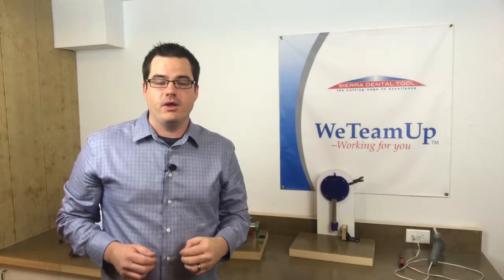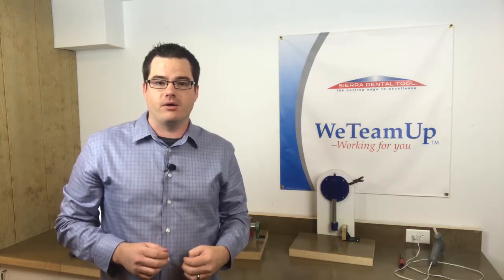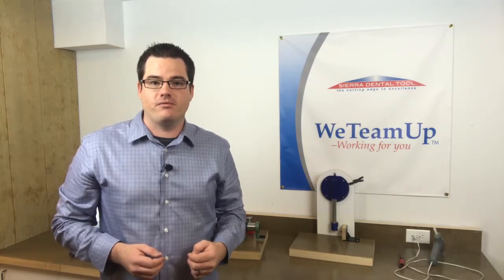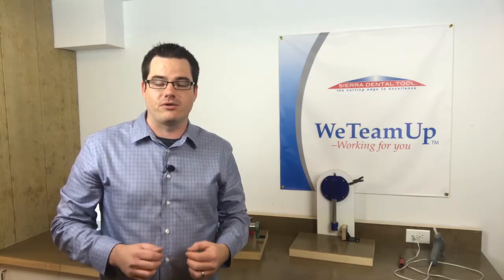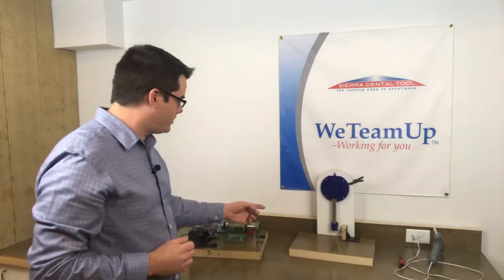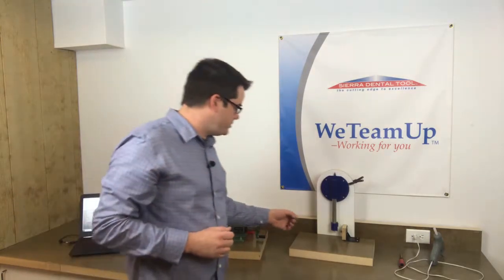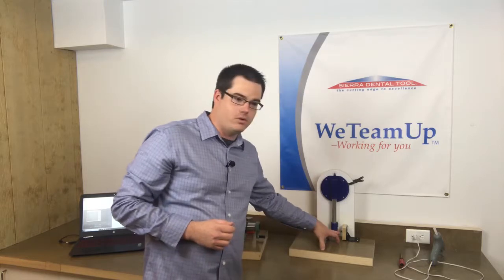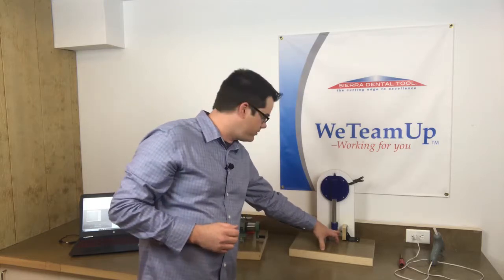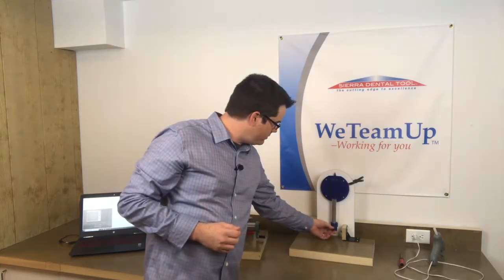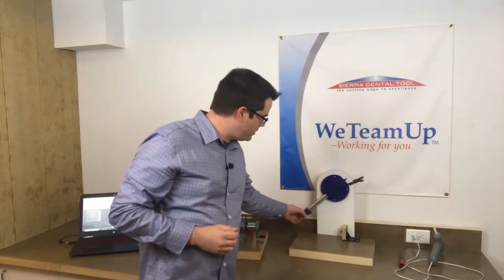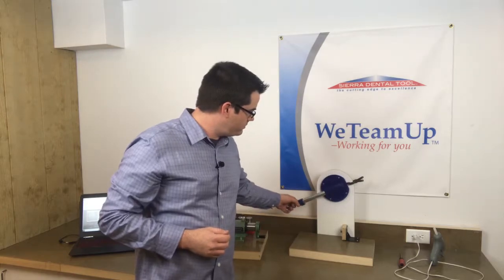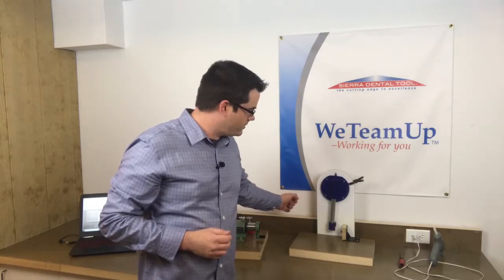For the first test we're gonna simulate a tool impact into a brass tool holder. A lot of CAD cam milling machines have brass tool holders—it's fairly common to damage a tool when you're installing it if you're not paying attention. So we've got the tool mocked up in the pendulum and I've got a brass tool holder set up as an impactor. Let's go ahead and do the test. There's the impact.